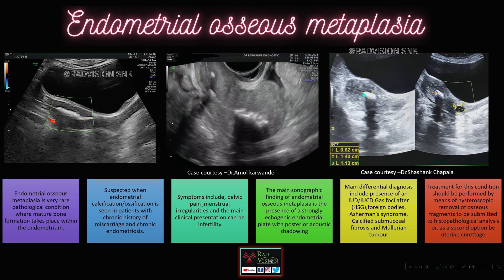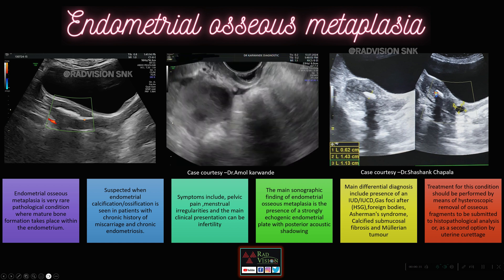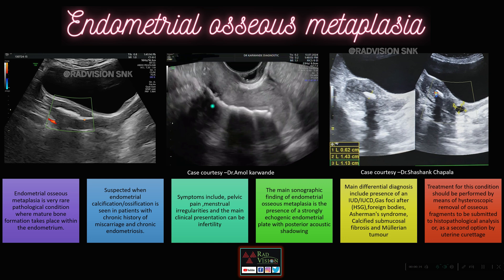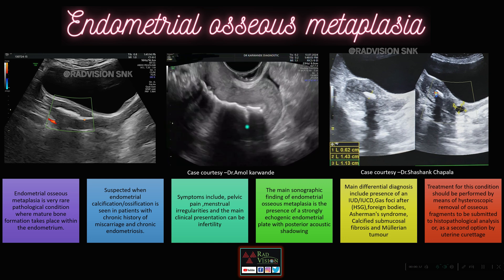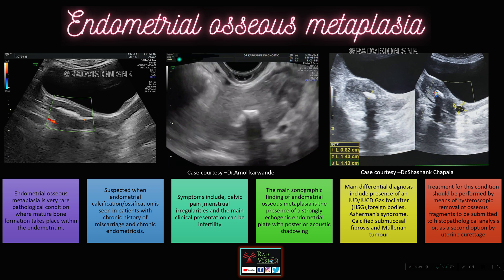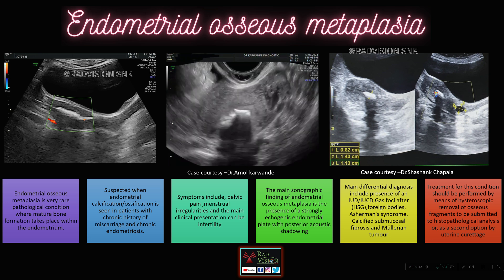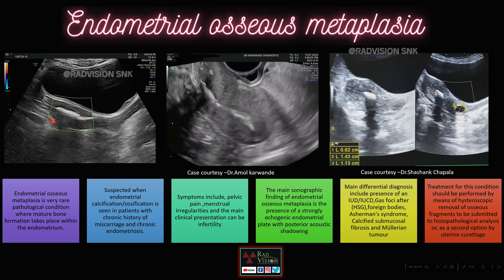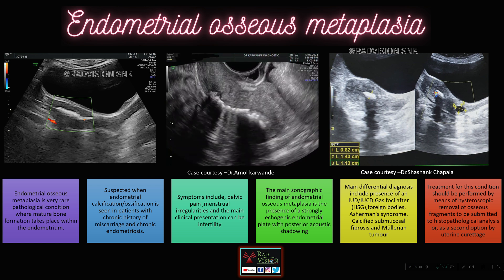This is another case where you can see calcifications in the lower endometrium with post-acoustic shadowing, and even a Nabothian cyst in the cervix. Here you can see dense endometrial ossification with post-acoustic shadowing, and incidentally you can also see a hemorrhagic cyst or endometriotic cyst in the right adnexal region.